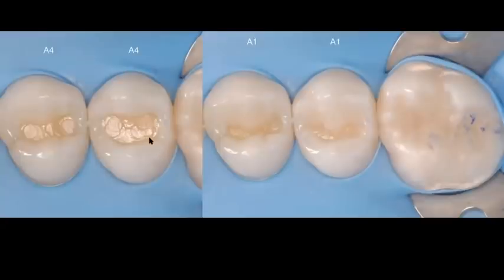And the reason why I do that, again, we're talking about lifelike restorations. We all know that the dentin is more saturated, has more color, more yellow to it compared to the enamel. So what I want to try to do with using A4 composite is mimic that yellowish dentin shade so that I can create some depth in my restoration. Meaning that when you see through my A1 that I'm going to use for the cusp inclines, you will get some of that yellow coming out through that A1 shade.